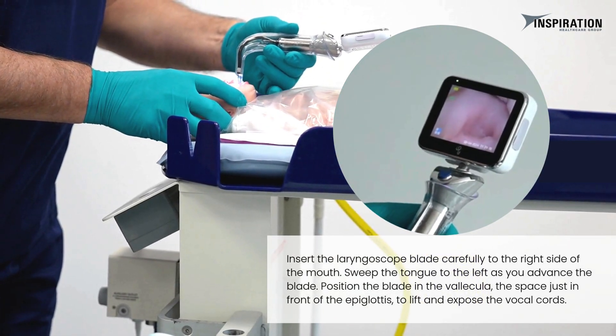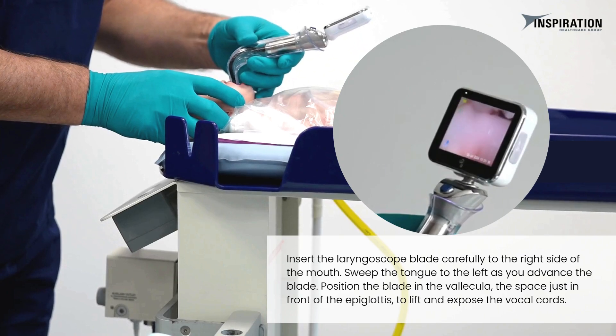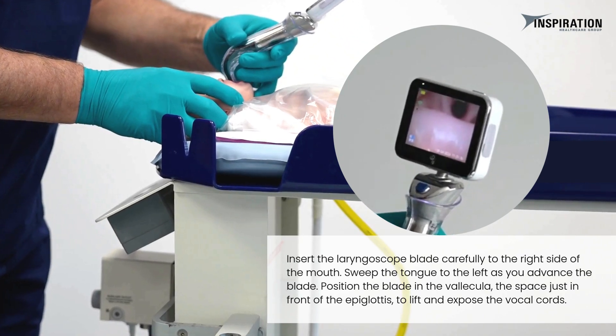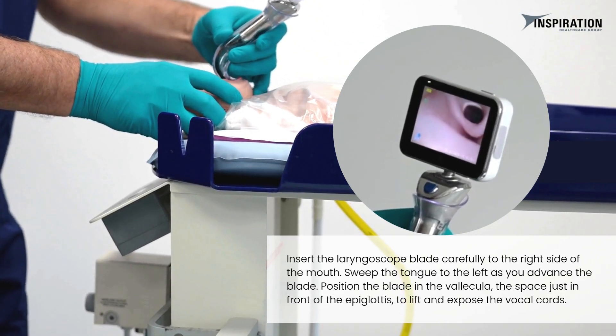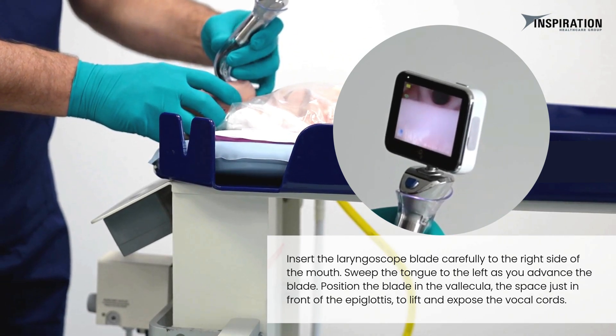Insert the laryngoscope blade carefully to the right side of the mouth. Sweep the tongue to the left as you advance the blade. Position the blade in the vallecula, the space just in front of the epiglottis, to lift and expose the vocal cords.